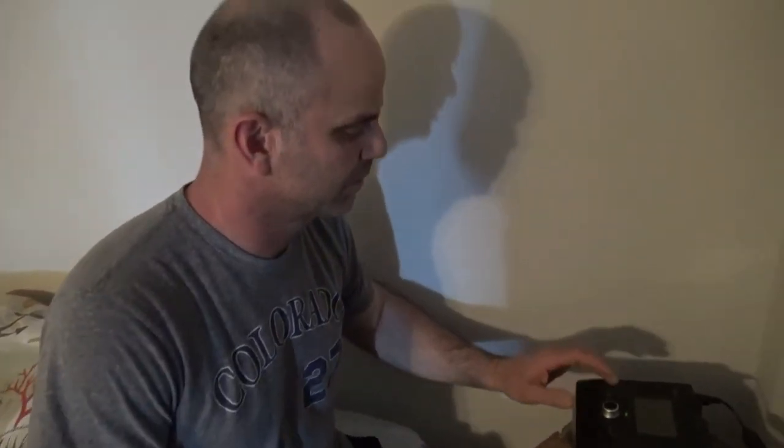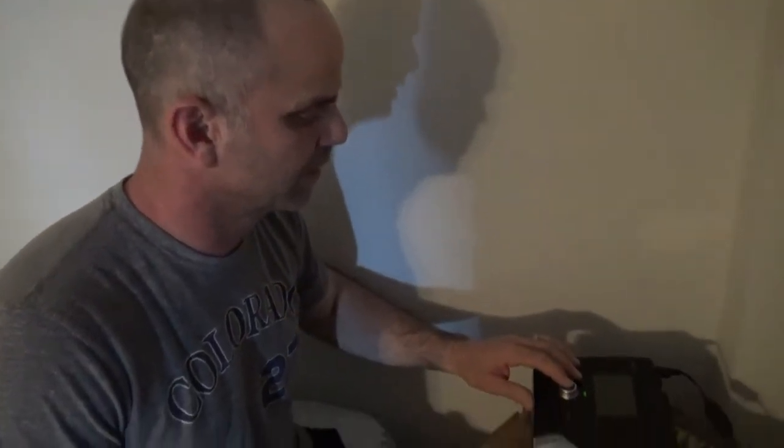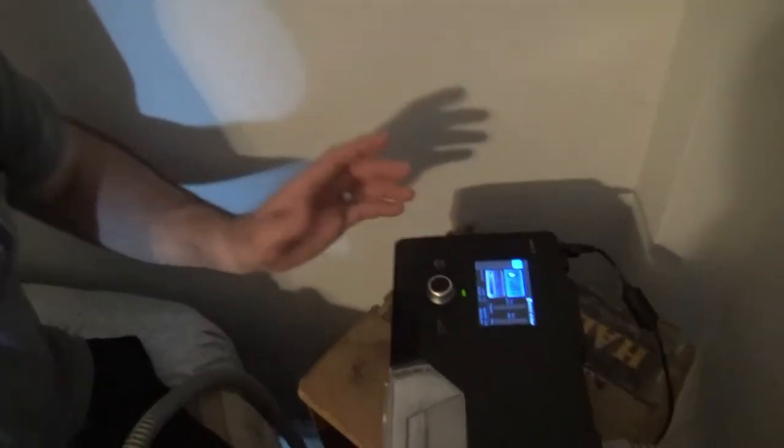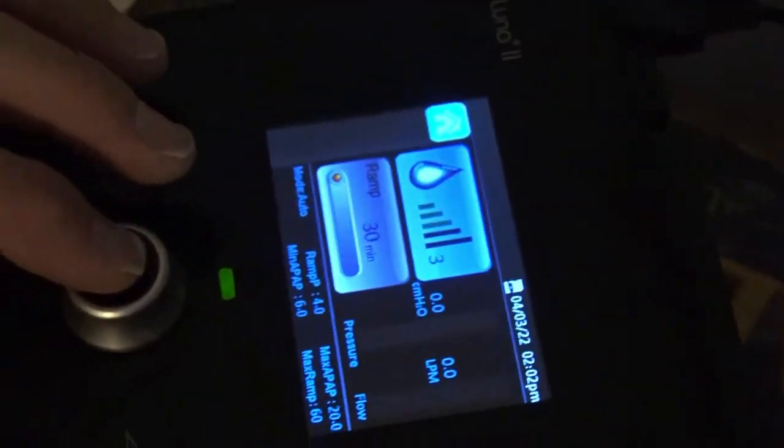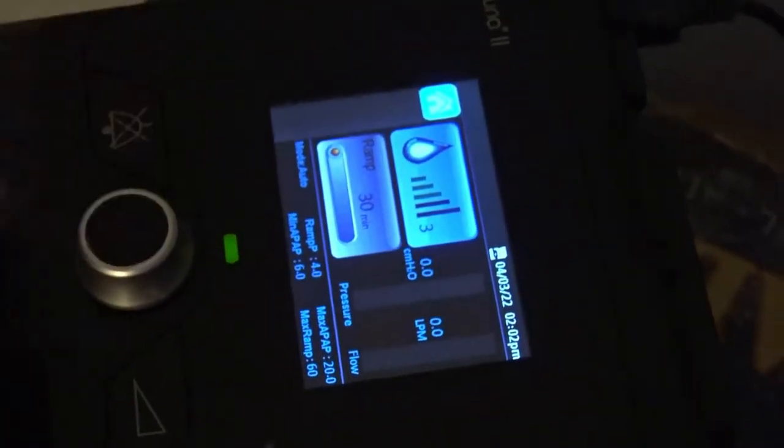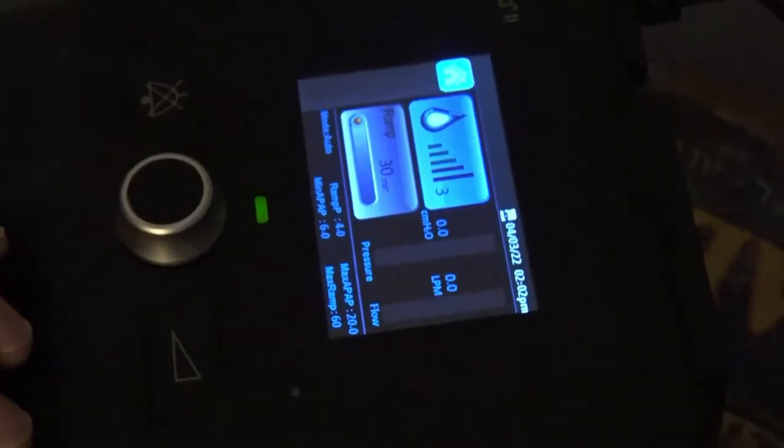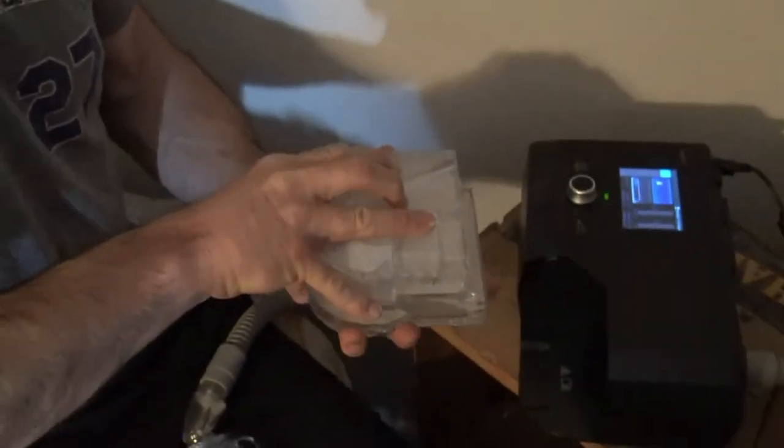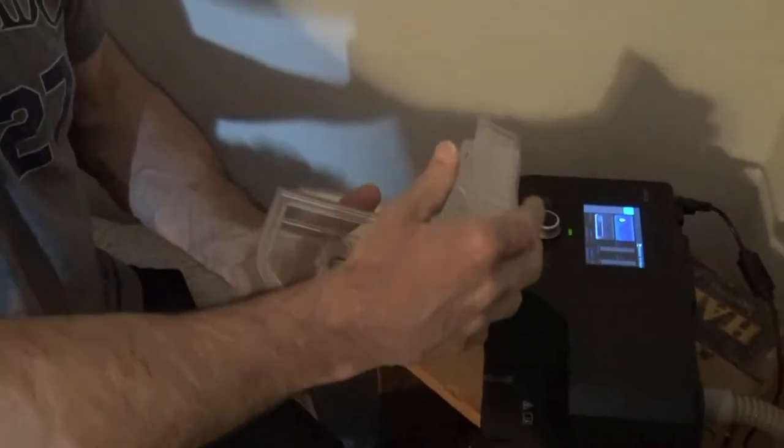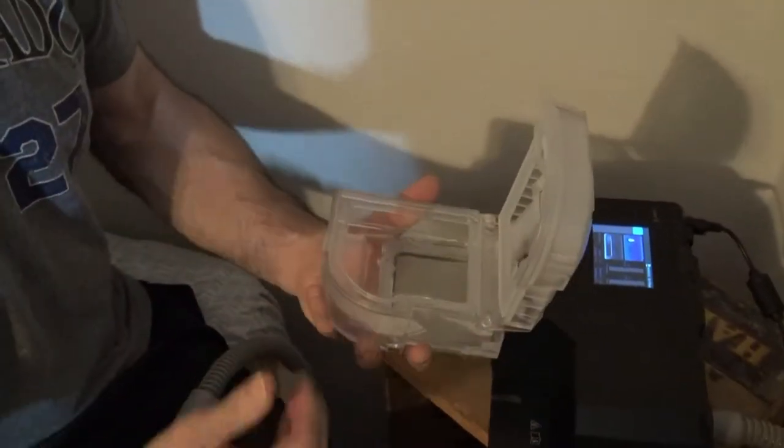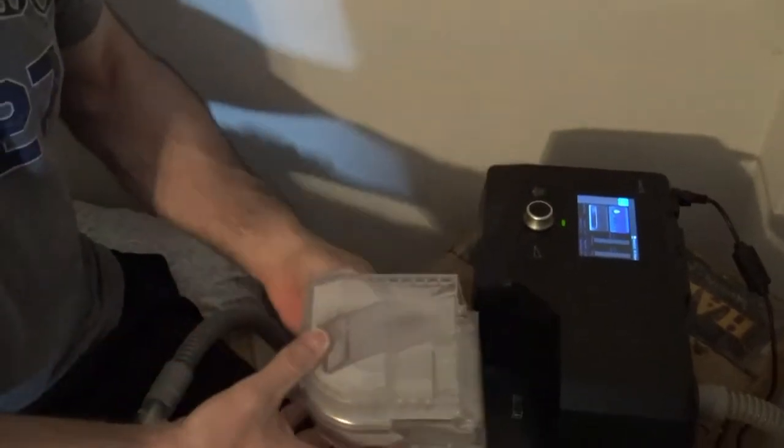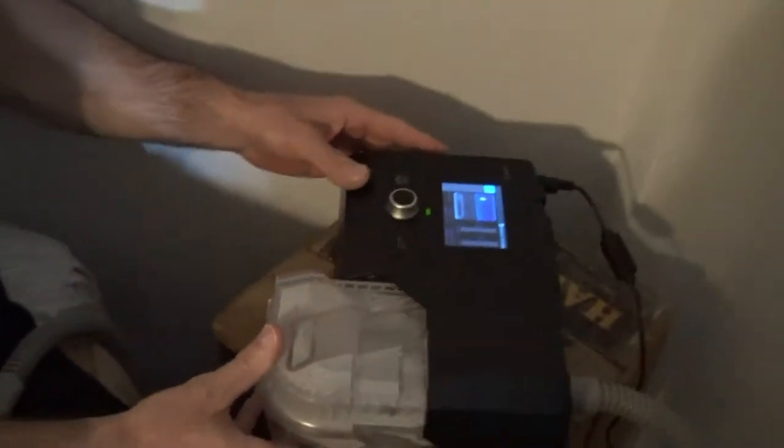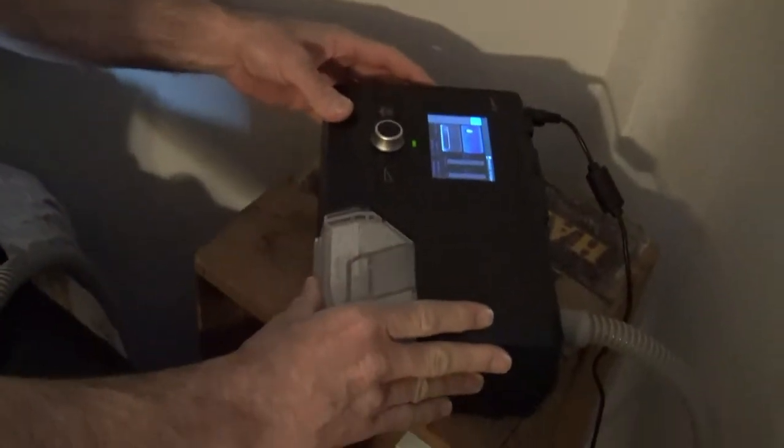All you do is turn it once to turn it on, and then the settings are already in it. Before I do that, I take this out and just fill it with distilled water, which you're supposed to empty and clean daily. My wife will probably talk more about that in a bit.